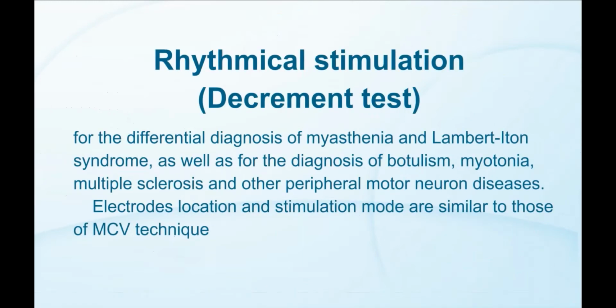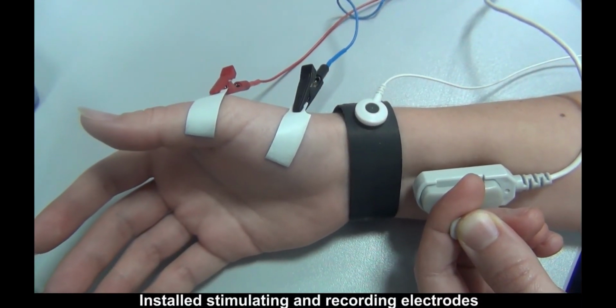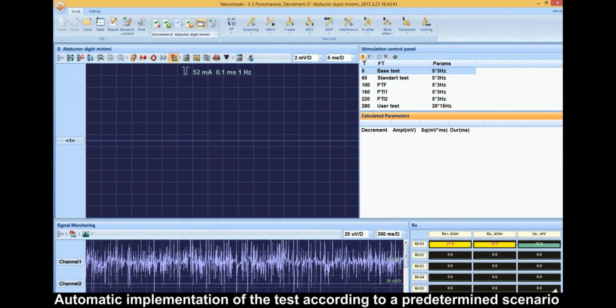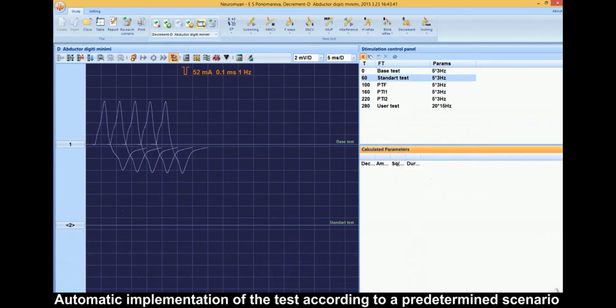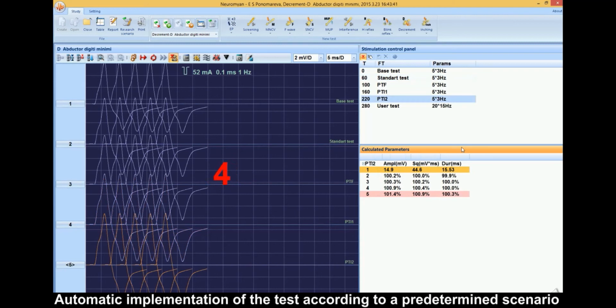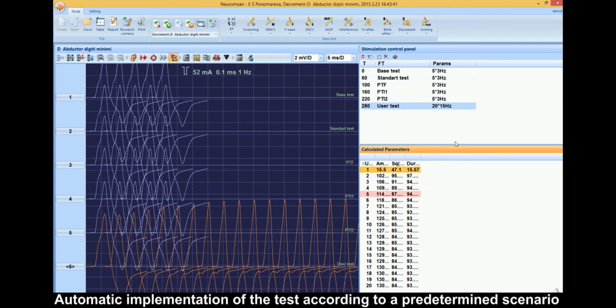For the differential diagnosis of myasthenia and Lambert-Eaton syndrome, as well as for the diagnosis of botulism, multiple sclerosis, and other peripheral motor neuron diseases. Automatic implementation of the test according to a predetermined scenario. Stimulation scenario contains the most frequently used functional tests: a basic test, standard test, maximal voluntary contraction, relaxation or post-tetanic relief, post-tetanic exhaustion, and user test.